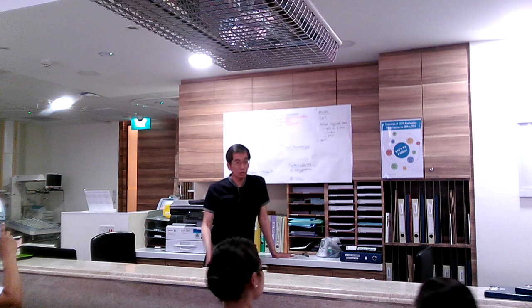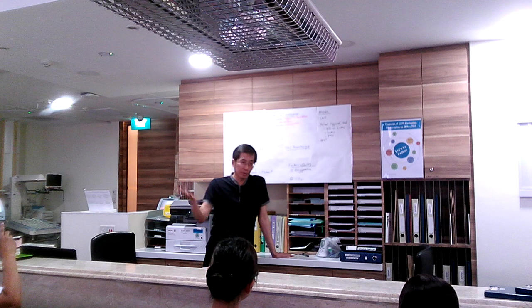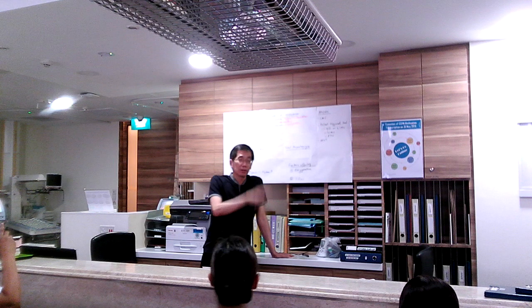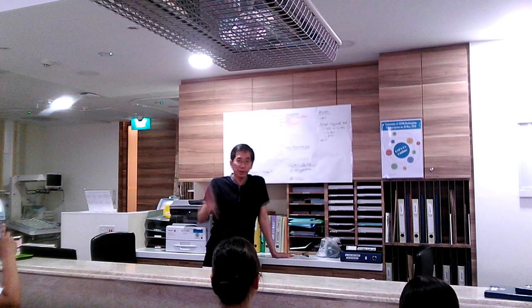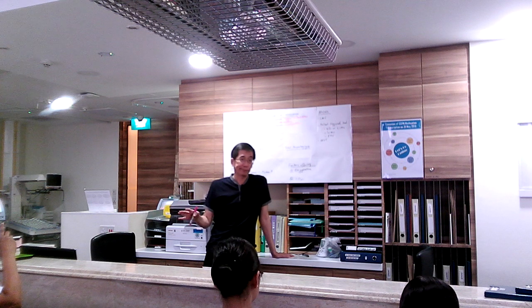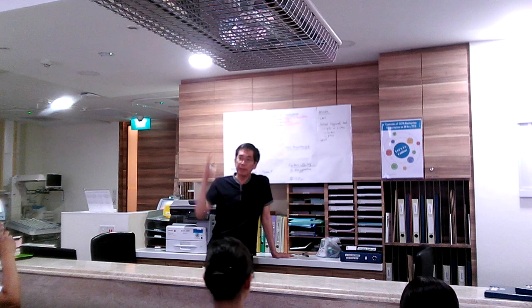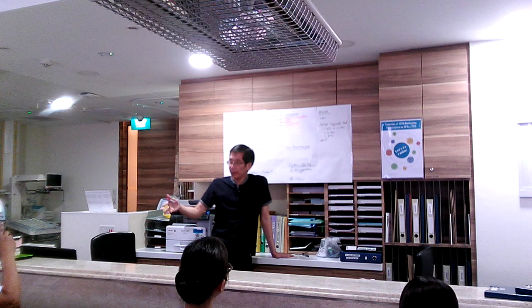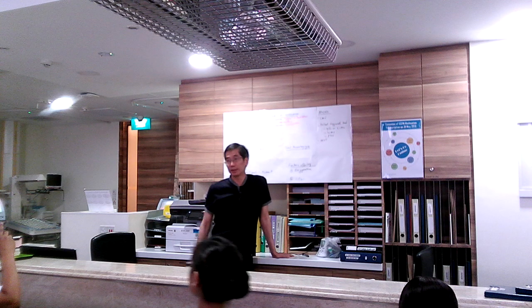Okay, so what will happen is that you will be having 2 types of breath. One is a pump breath, which is set by you, and in between the baby will be just breathing on his own, unsupported. So the baby will be breathing, and then when it's time to pump, he'll pump, and then breathing. Something like what you're seeing over there on the ventilator.